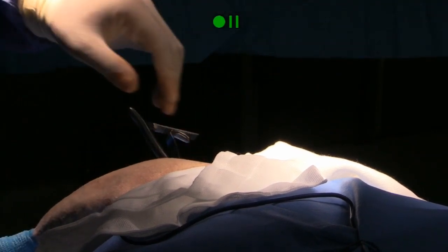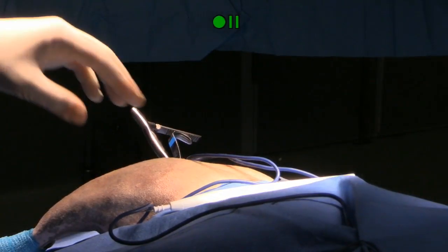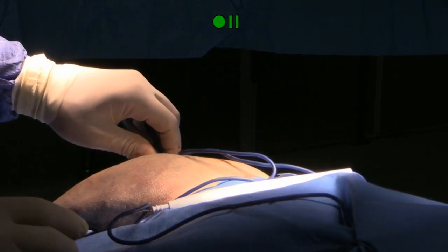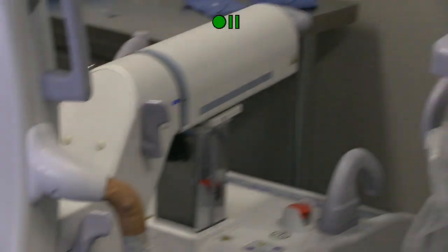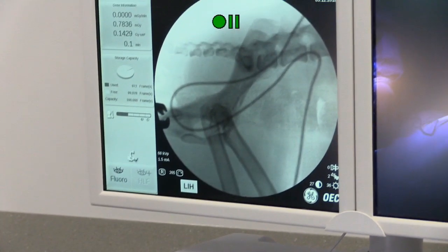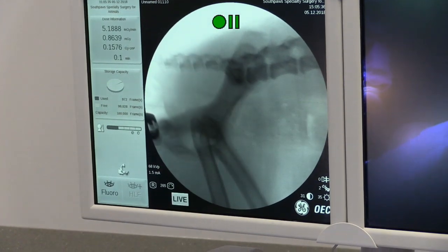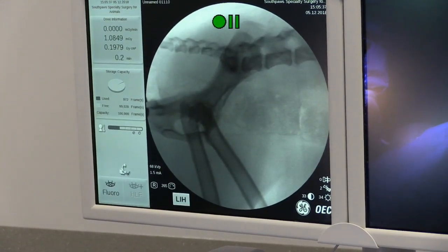So James has got a solid grip now on the ischium using a Kern bone-holding forcep. You can see that he can basically move the whole dog. Come back over to the fluoro now, so I can manipulate where this is in there too.